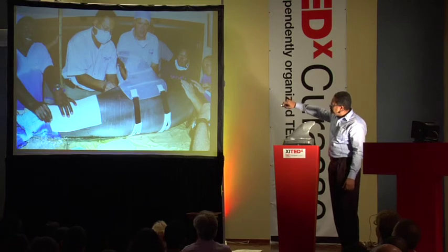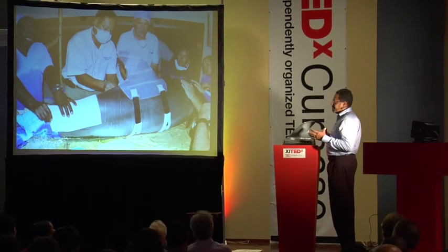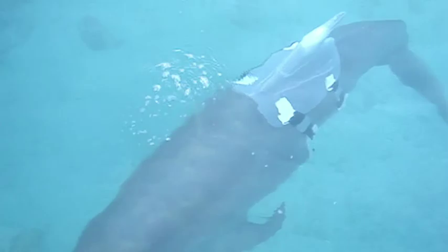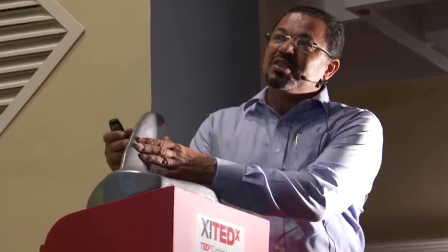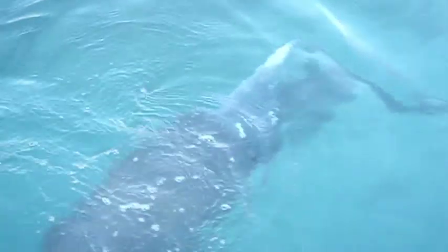We also designed special straps with silicone coverage for it to hold and not give any abrasion on the body side. Here you see the animal in the water. The words of the trainer were amazing: "Wow, this is awesome." And they were checking everything. They were checking to see if there was any abrasion inside. They were even smelling if there was any infection going on. All of that was perfect. And it was just the one try that fitted and worked.